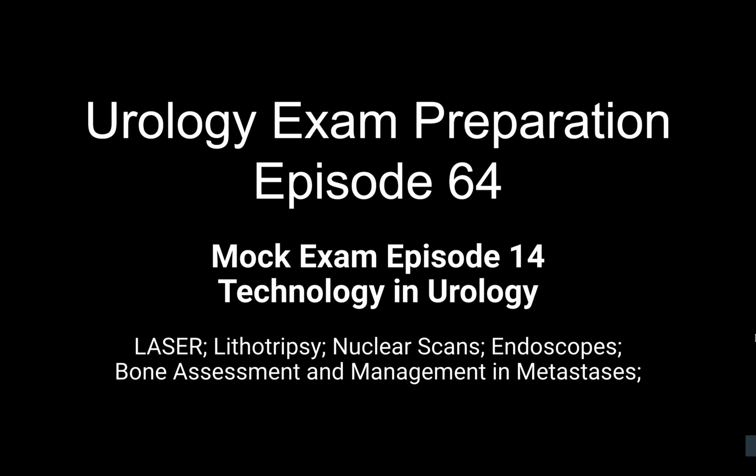I will be happy if you are a little bit stronger on the digital front, because even the reusable digital ureteroscopes have the same principle. You are quite good on chip-on-the-tip technology, which results in a bulky tip and inability to have appropriate flexion in the tip. But there are a few other things: digital scopes don't require white balance.